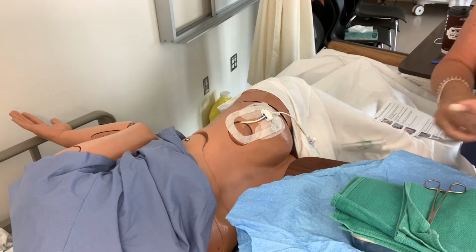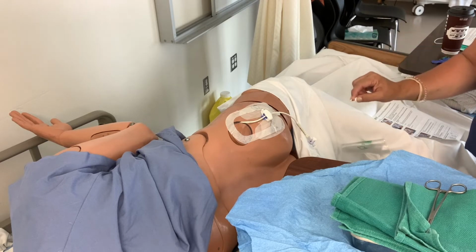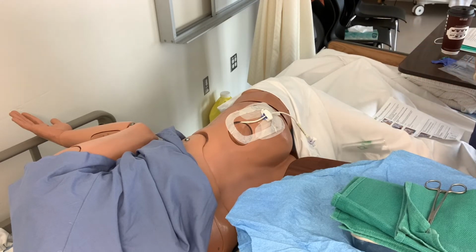So I've opened my dressing tray and I've gathered my supplies. Since I'm going to flush it, I need 2 syringes full of sterile saline, so the pre-filled 10 mils, I have 2 of those. And because I'm going to disconnect it, I have to clean the disconnection joint, and I'm going to use 2 chlorhexidine swab sticks for this.